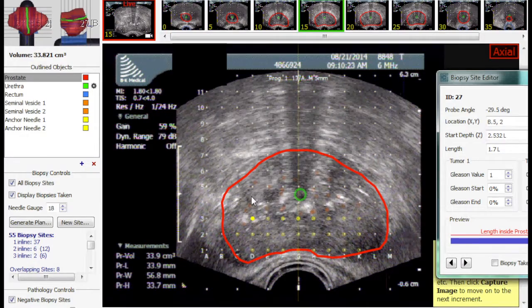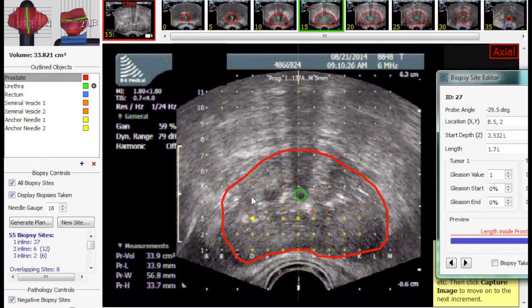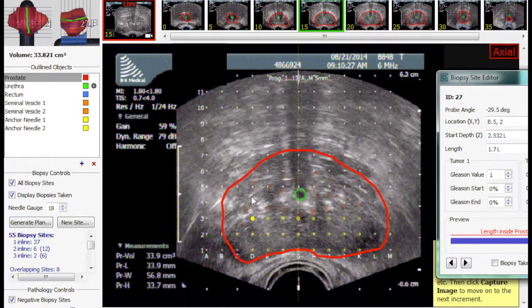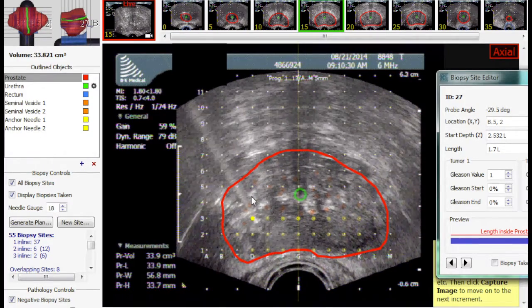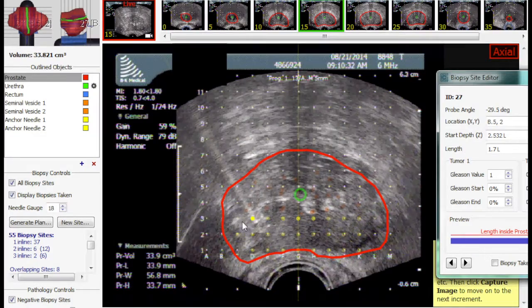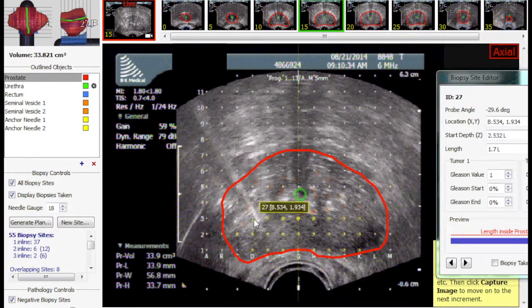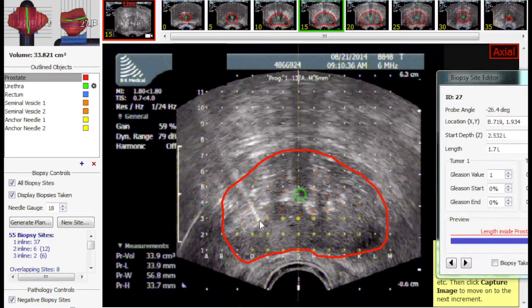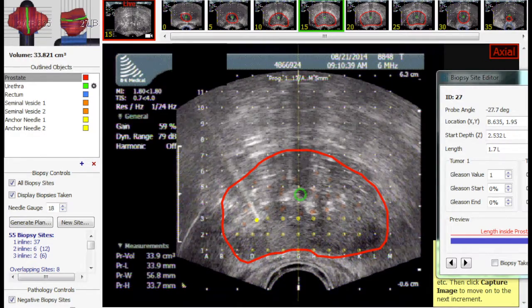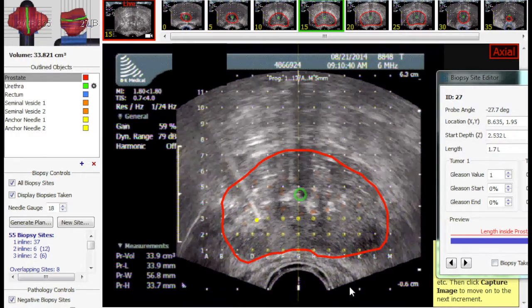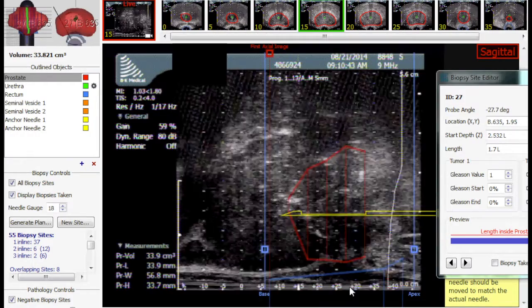The biopsy is to be taken from the right lateral aspect of the prostate. The needle is inserted at its designated place and the probe is rotated so the needle point is in the midline. The probe will then be switched to sagittal imaging and the needle will be viewed just prior to the biopsy.